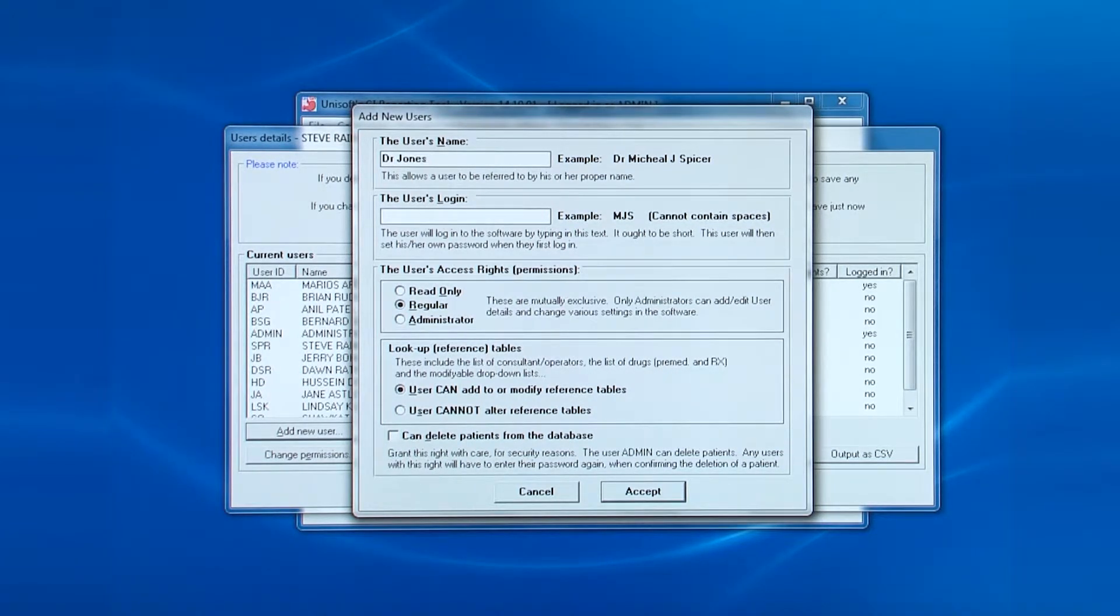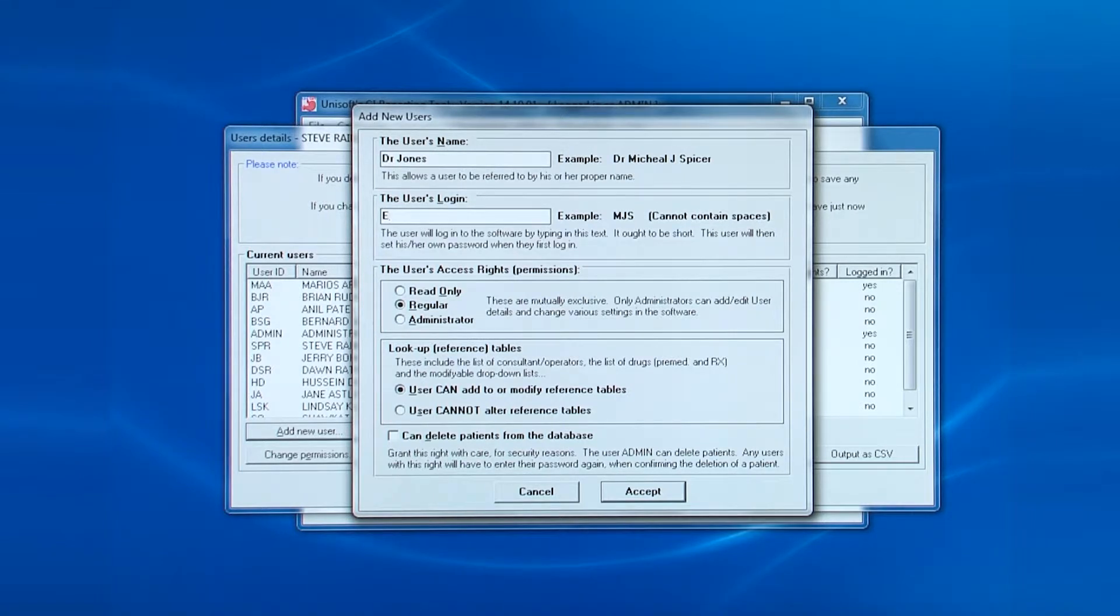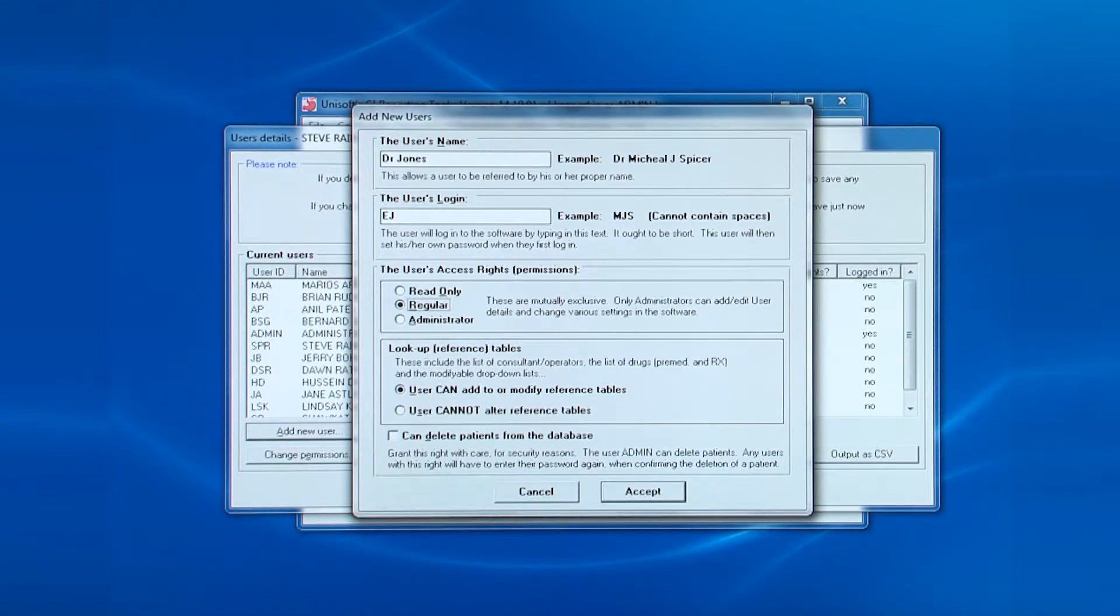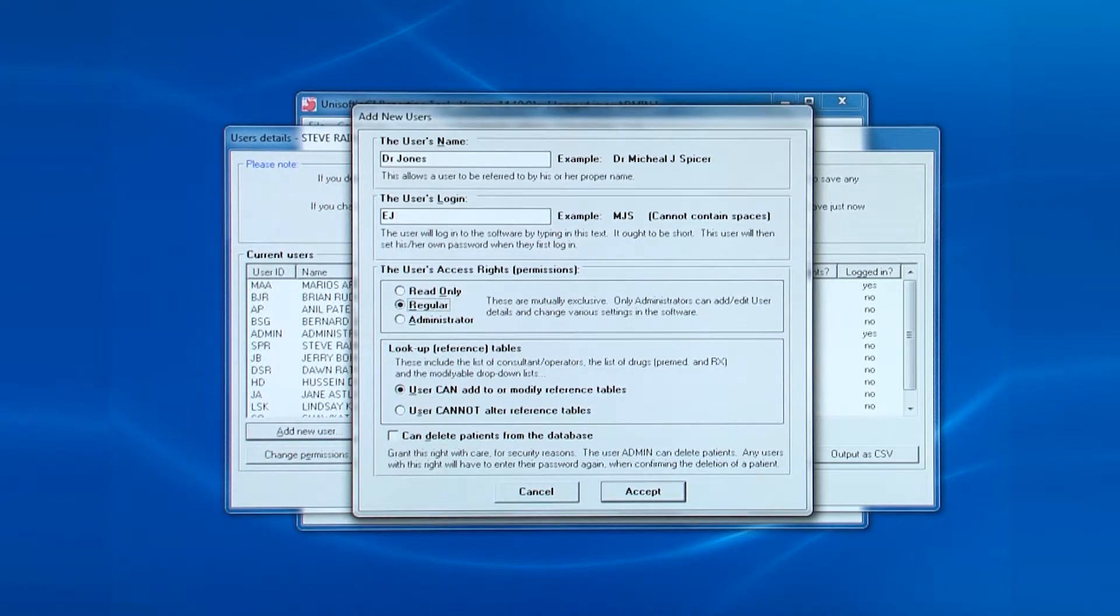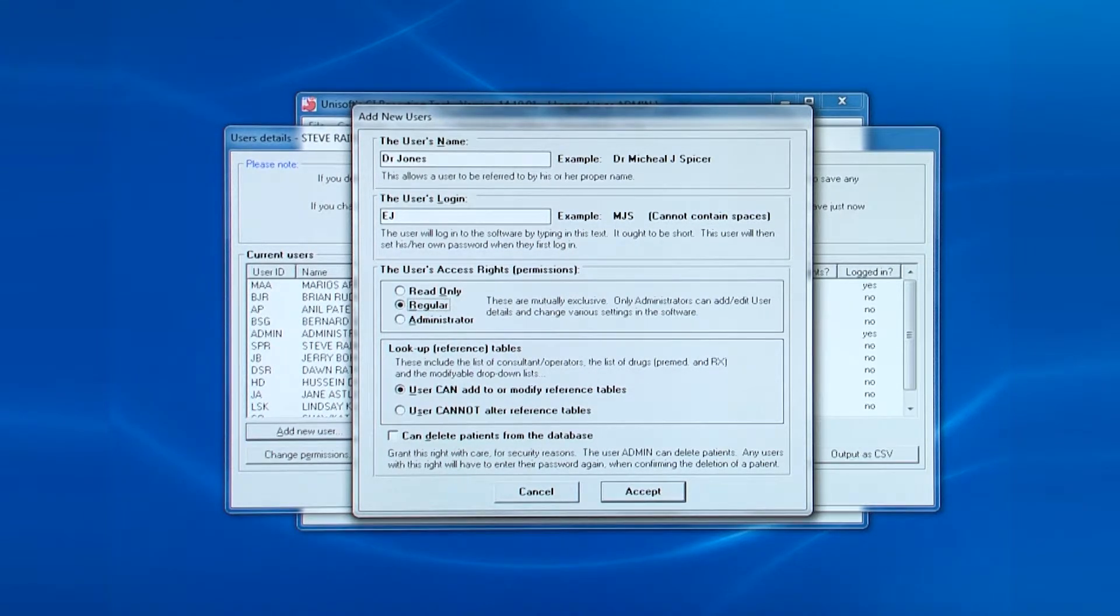The next thing is their login ID. And contrary to this example, please use their regular NHS or trust login. There is no reason to create yet another login that has to be remembered by the poor user.